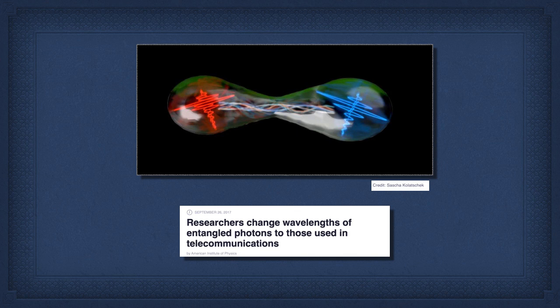The problem is that these pairs are only produced in extremely low intensities. And it's attractive. It gives you not only the reflection from surfaces, but it gives you composition by measuring the group velocity dispersion in that region, unaffected by the region it passed through, just that region.